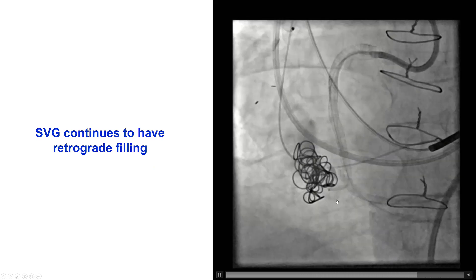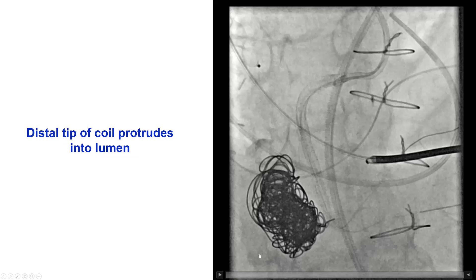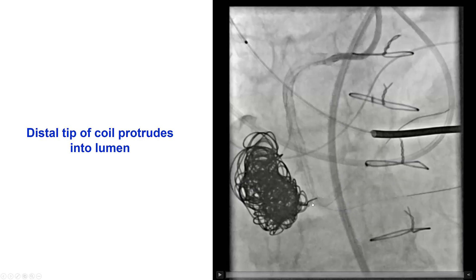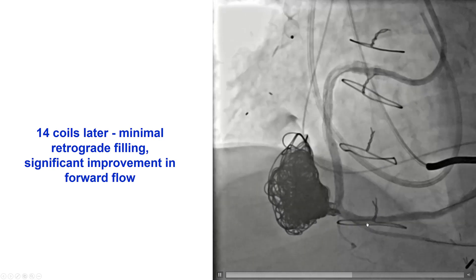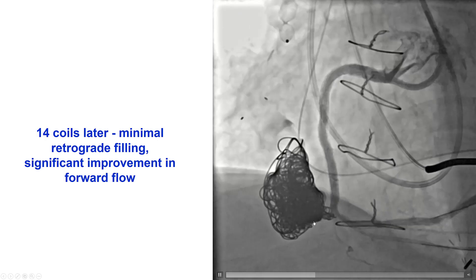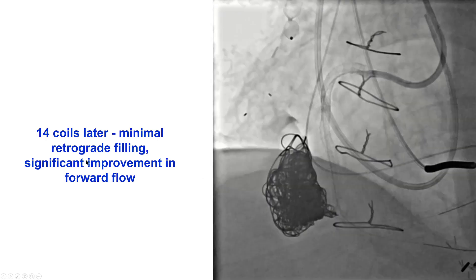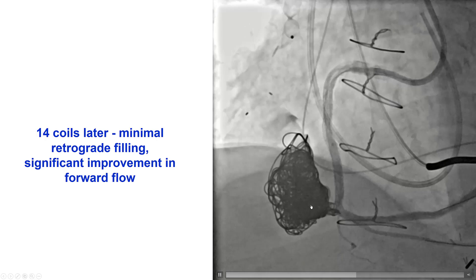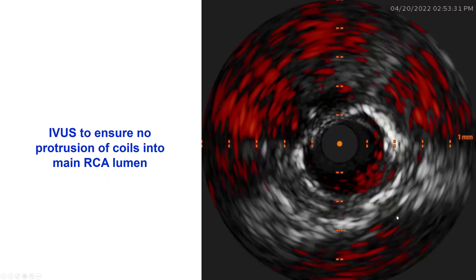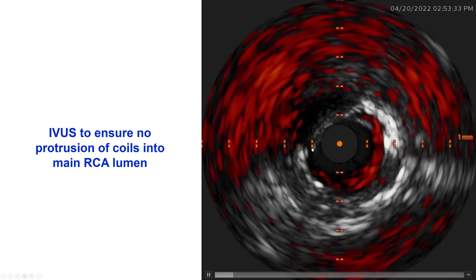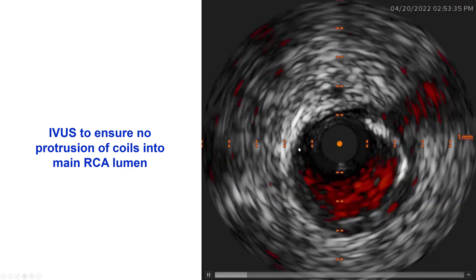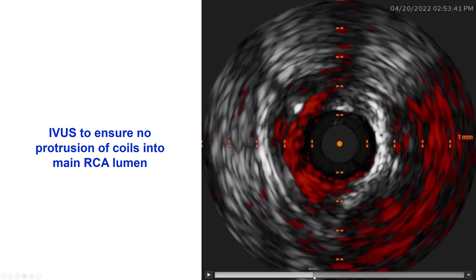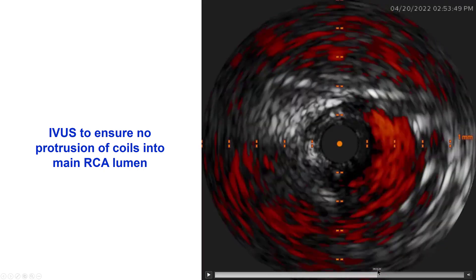There continued to be significant retrograde flow into the saphenous vein graft. We placed several more coils, and unfortunately with the last one, there was some protrusion of the tip of the coil into the lumen, which we pushed back using the antegrade microcatheter. This is how it looks after 14 coils — it took quite a large number. We achieved much decreased flow into the SVG aneurysm and much better antegrade flow into the right coronary artery. We performed intravascular ultrasound to confirm there was no coil protrusion into the native right coronary artery, and indeed there was none.